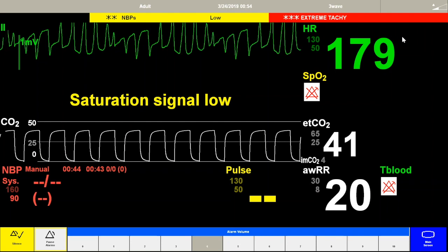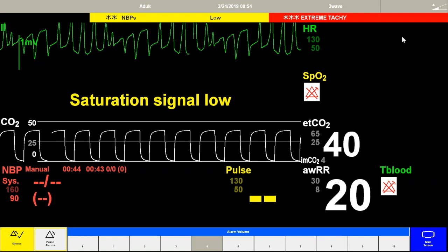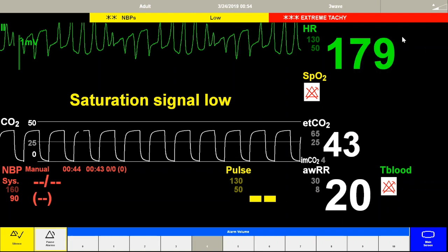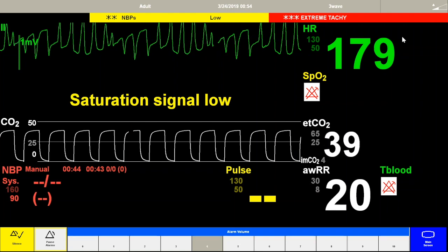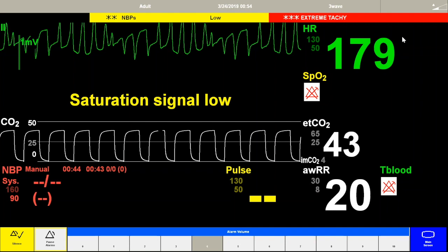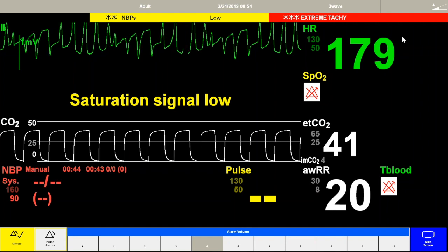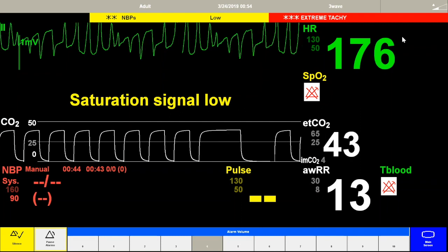While this person is in the care of the EMS or hospital staff, we notice that the patient has this wide complex rhythm. Vital signs and things are being done, and we can take some numbers off of the screen. This chaotic rhythm is a ventricular rhythm, and if you can tell, it does seem to be flipping. We consider this a polymorphic ventricular tachycardia, or Torsades de Pointes.